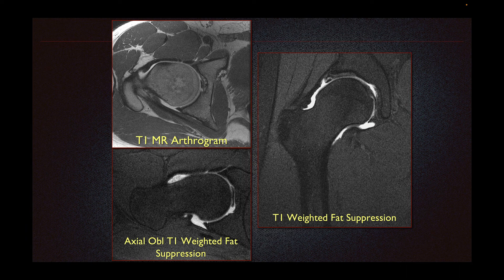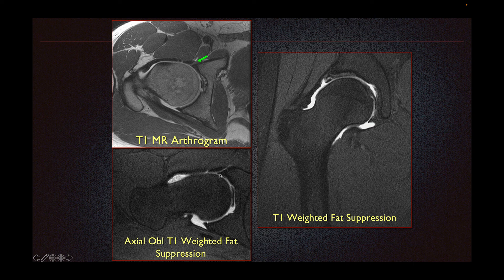This is an example of an abnormal labrum. On our T1-weighted imaging, we can see a bony protuberance at the femoral head-neck junction with associated hyperintensity within the labrum, correlating to this hyperintensity or bright signal on our T1-weighted fat-suppressed imaging consistent with an anterior labral tear. On our coronal T1 fat-suppressed imaging, we can again see the superior labrum with some fluid traversing the substance consistent with a labral tear.